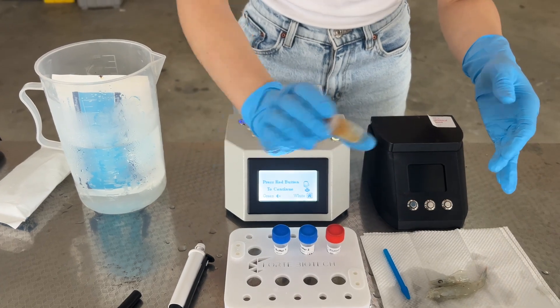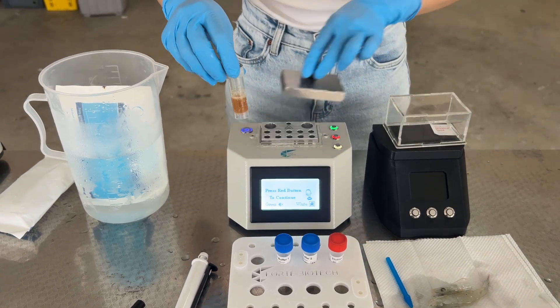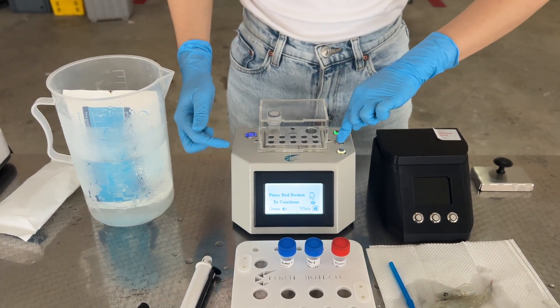Cap the lid tightly and give it a shake and flick before placing the tube into the heater. For the rapid heater, ensure the acrylic cover is in place and press the red button to start the lysis process.